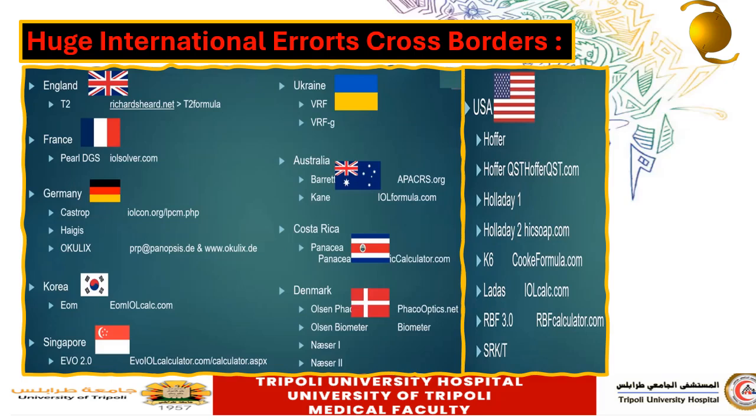So it is very important to cope with the concurrent improvement and evolution in technology, in the phaco machines, in the biometry machines, and in the technique of surgery. There should be an accurate and proper IOL calculation for better prediction of the IOL power.